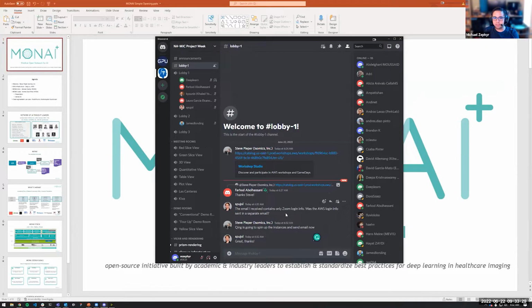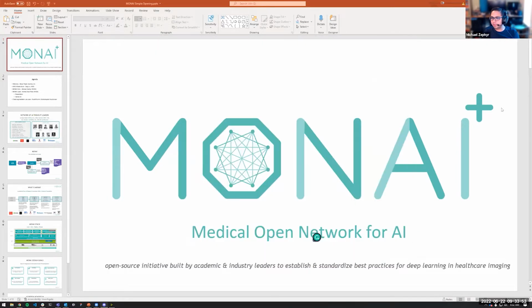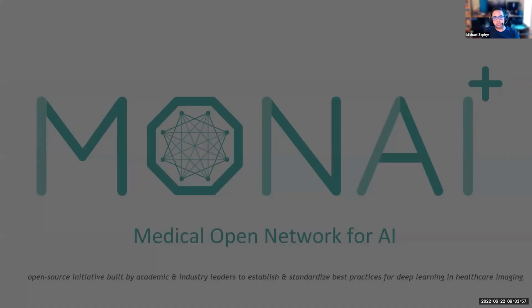And you'll see what I'm seeing here in the middle of my Discord screen, where Steve and a few others have already been commenting in that chat. I'll also monitor Zoom chat, and I have an aggregate doc where I'll collect all the Q&A. I'll stop the presenters as they go along when it makes sense and ask them any other questions that you have. So I'm going to get started with the intro to MONAI for those who don't know what MONAI is, and then I'll hand it off to Andres.